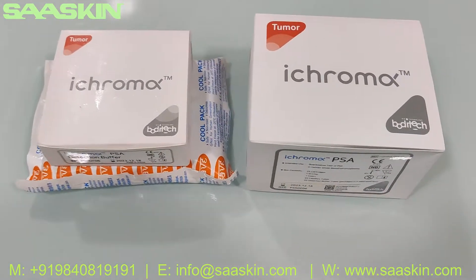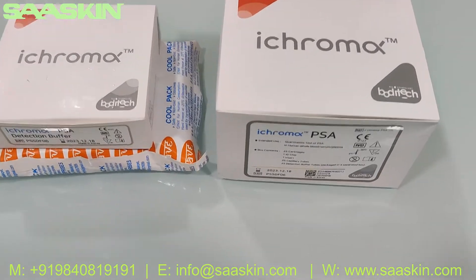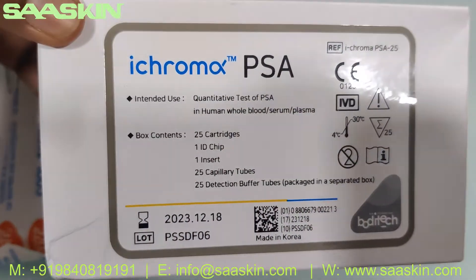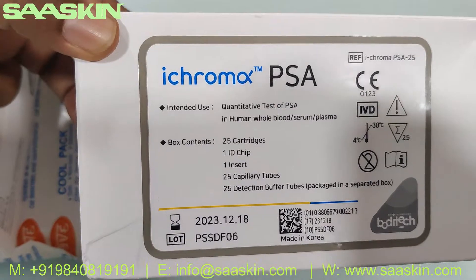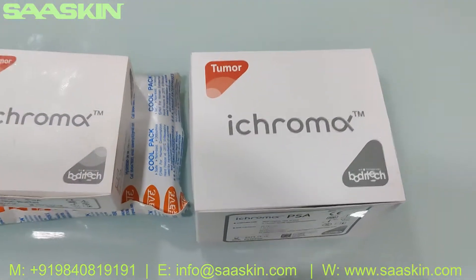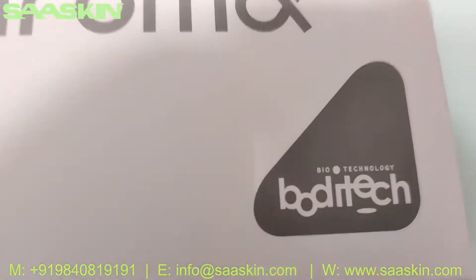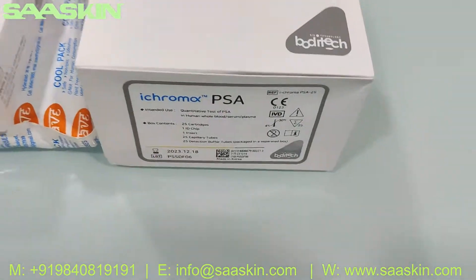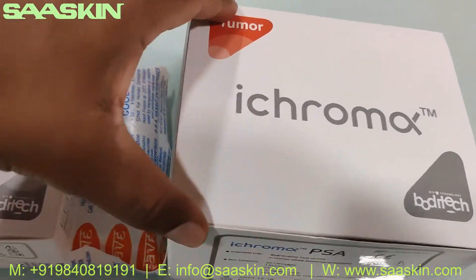Hello everybody, today we're going to see the introduction and unboxing of the ichroma Prostate Specific Antigen test kit. This is basically for tumor testing and it is from Boditech — Boditech's ichroma PSA test kit. I'm going to give an introduction about this kit and also unbox this for you.